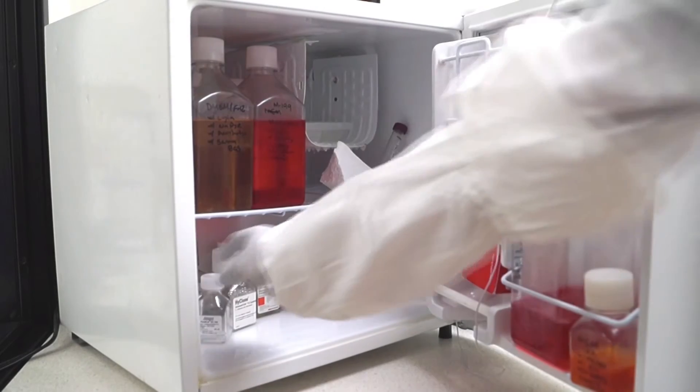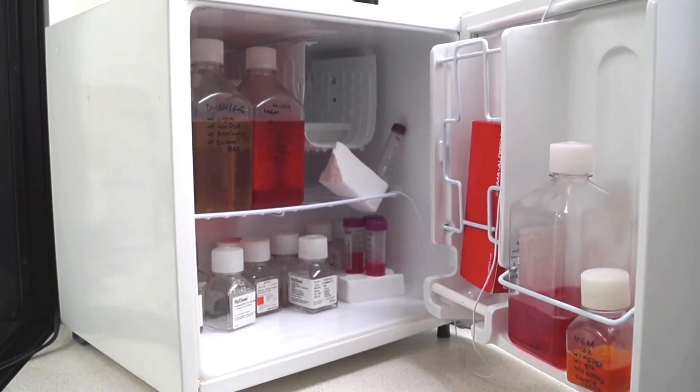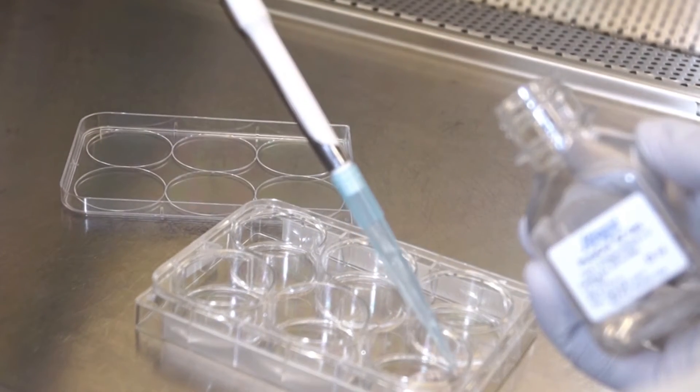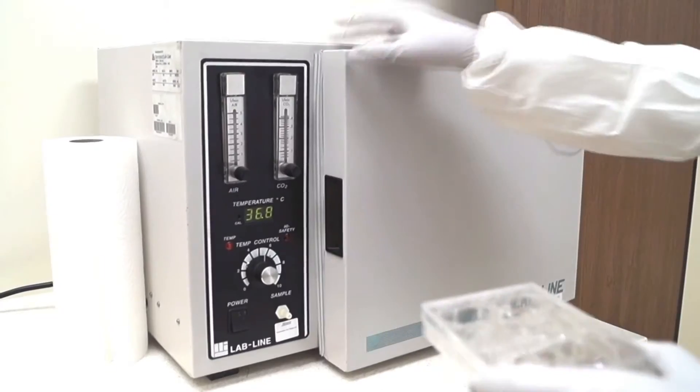To form a 3D gel, first remove the collagen from the refrigerator. Second, dispense the collagen into your desired dish. Third, incubate.